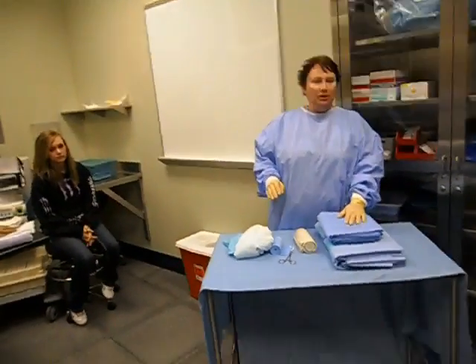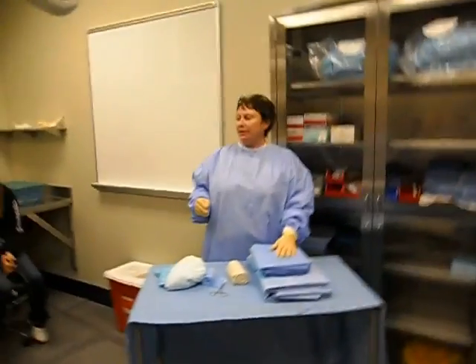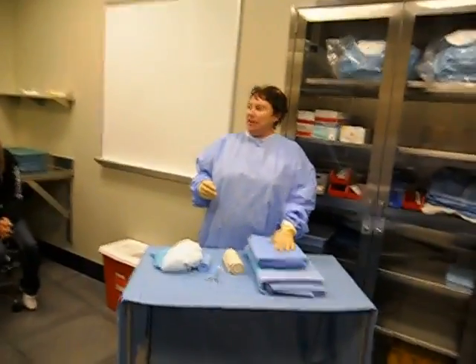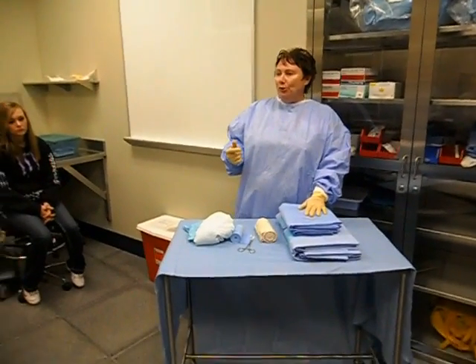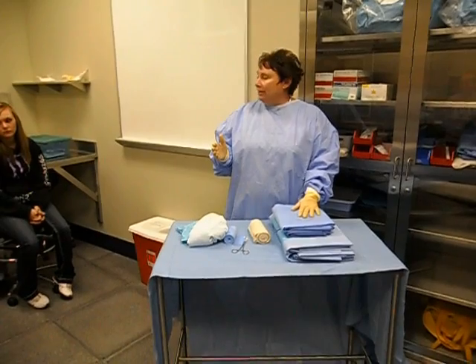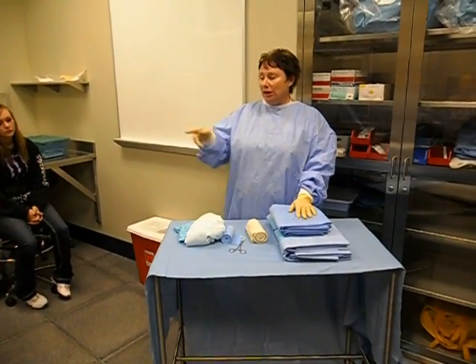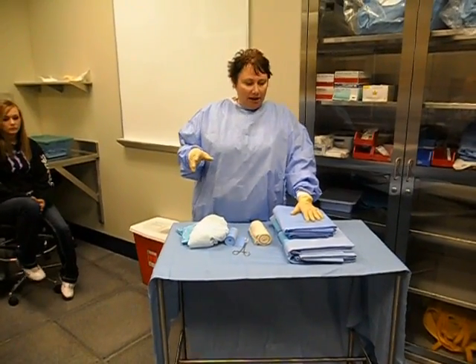This is going to be your skill for an extremity drape. We're just going to pretend today that the patient is having a knee procedure done. You know from when you did your prepping that if they're having a knee procedure, we would prep from the ankle to the mid-thigh. In this case, the patient's going to have a tourniquet on, and so we're going to drape this left leg.